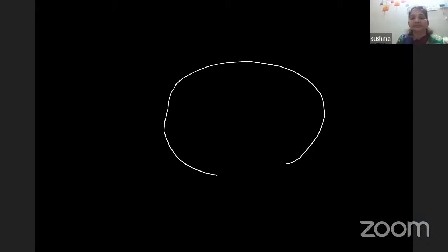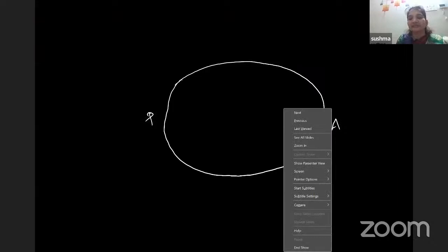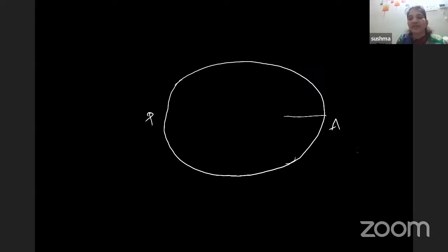Now, I'll try to draw the transcerebellar plane again. This is the anterior aspect, this is the posterior aspect. Here we have the anterior 1/3. In the anterior 1/3, we have the midline falx interrupted by a rectangular box-like CSP. Then again in the posterior part, we have the falx. Here we have the cerebellum, which is dumbbell shaped. Normal cerebellum is dumbbell shaped. And this part here is the cisterna magna. This is the fluid-filled structure that we have, the cisterna magna.